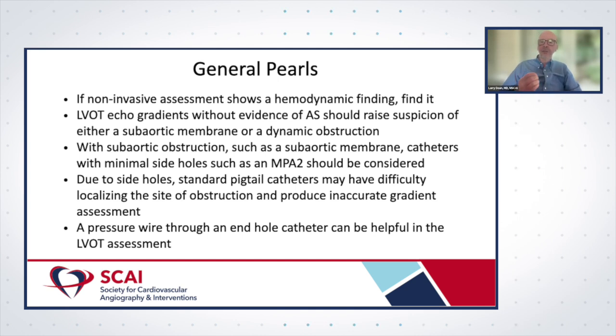This is a beautiful case report and a beautiful example of, gee whiz, we didn't find it, but then we did find it because we looked for it harder. So hats off to the people who did the procedure and persisted with it, rather than just saying, well, I don't see it, it must not be there, the echo must be wrong or whatever. Once you see something like that, prove to yourself that it's not there, rather than saying, I can't find it, try to find it.